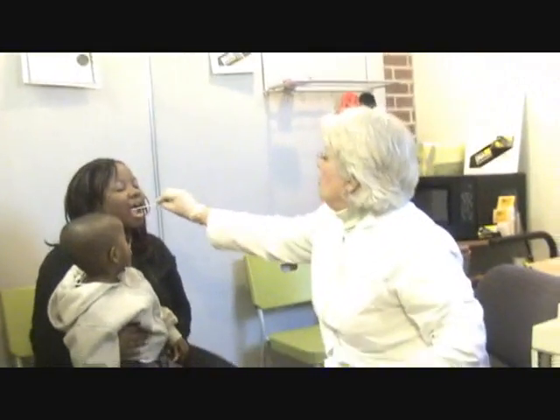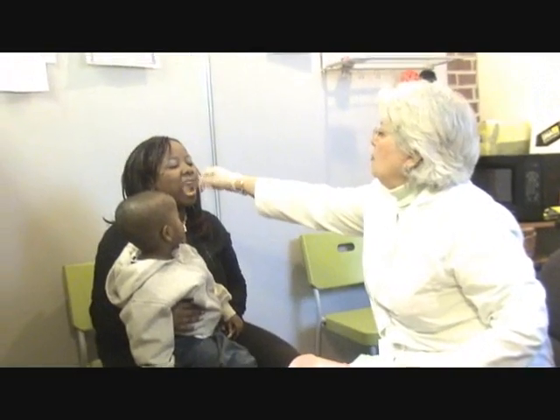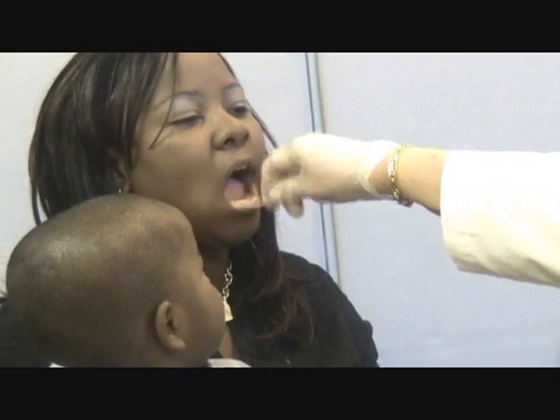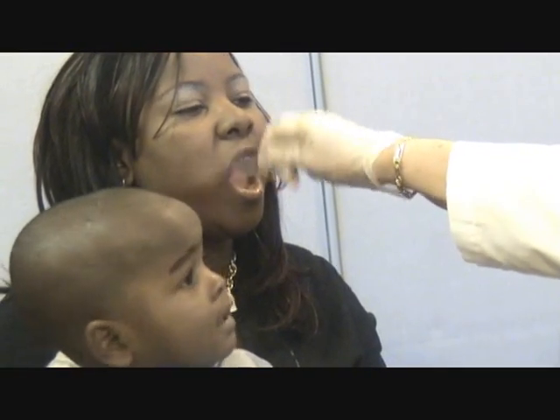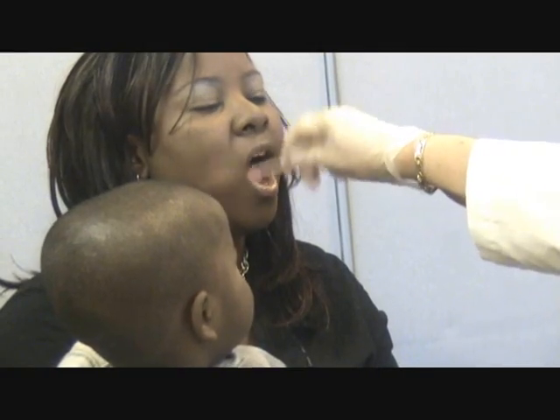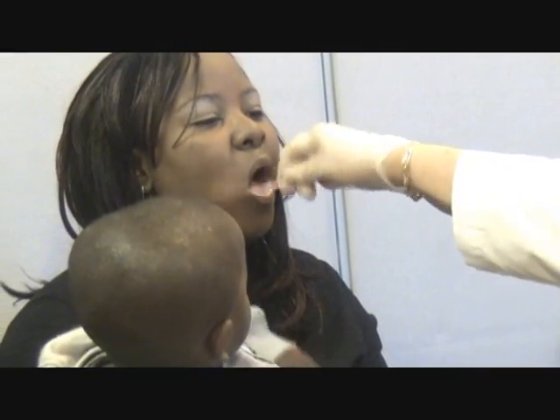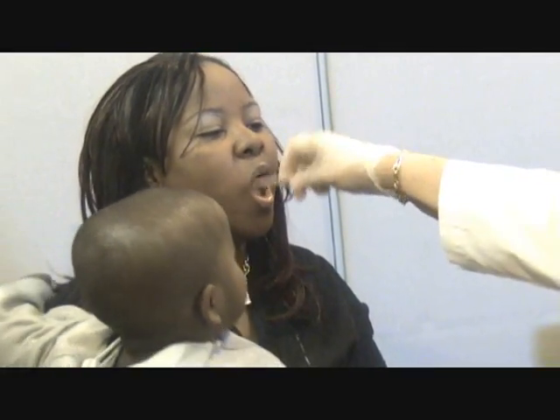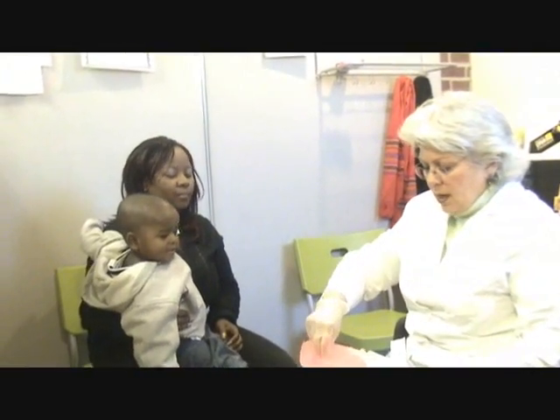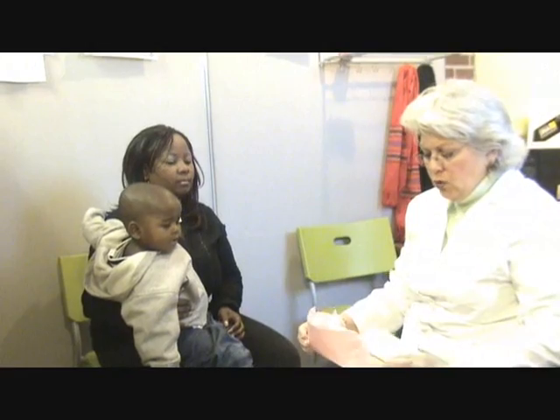I put the swab inside of Monica's mouth and I am scraping the skin cells from the moist skin inside of her cheek. I'm going up and down and I'm twirling it, and I'm doing that 15 to 20 times. Then I place this into the envelope.